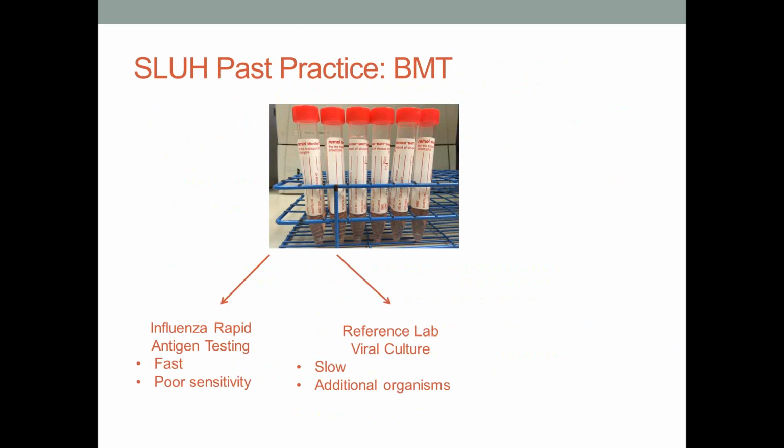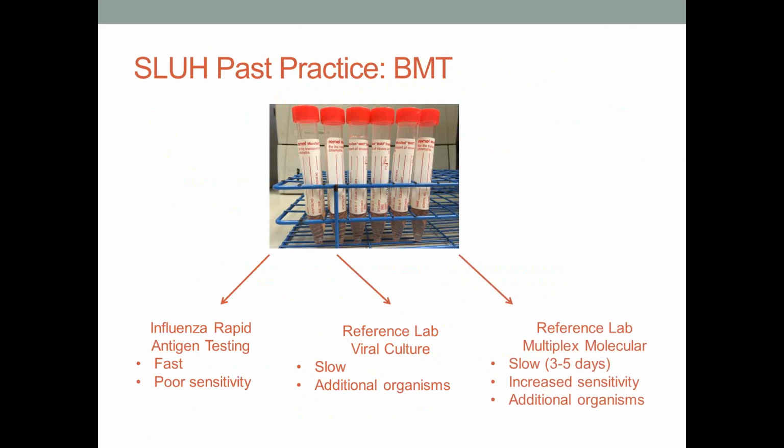I wanted to tell you a little bit about our approach in the past to viral testing, and I'm going to divide that into how our bone marrow transplant team approached that versus our inpatient team, because they had a little bit different way that they looked at this testing. So when I came to St. Louis University Hospital 5 years ago, we were not performing any molecular testing in the microbiology lab. We were doing rapid flu antigen testing as our only respiratory viral test in-house, and viral cultures were sent out to a reference lab. So over time, we shifted from sending out viral cultures to sending out multiplex molecular testing, but it was still going to a reference lab.